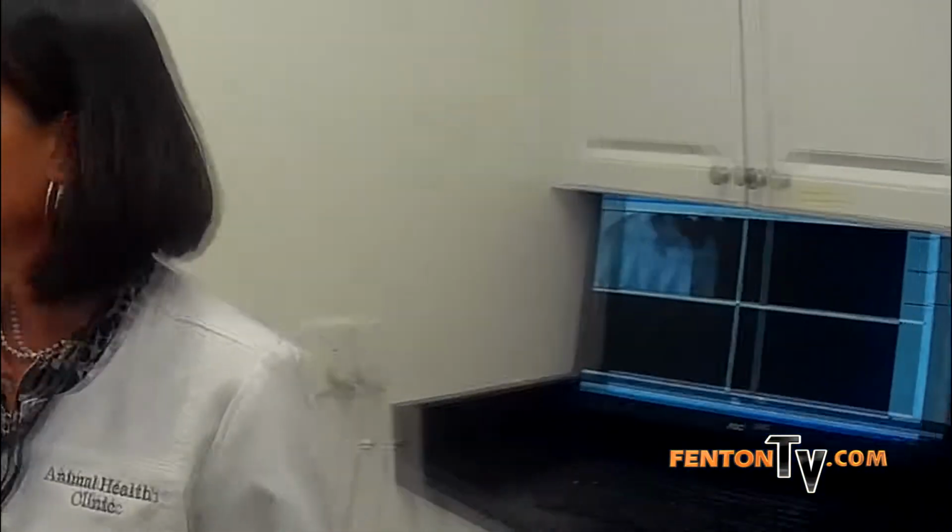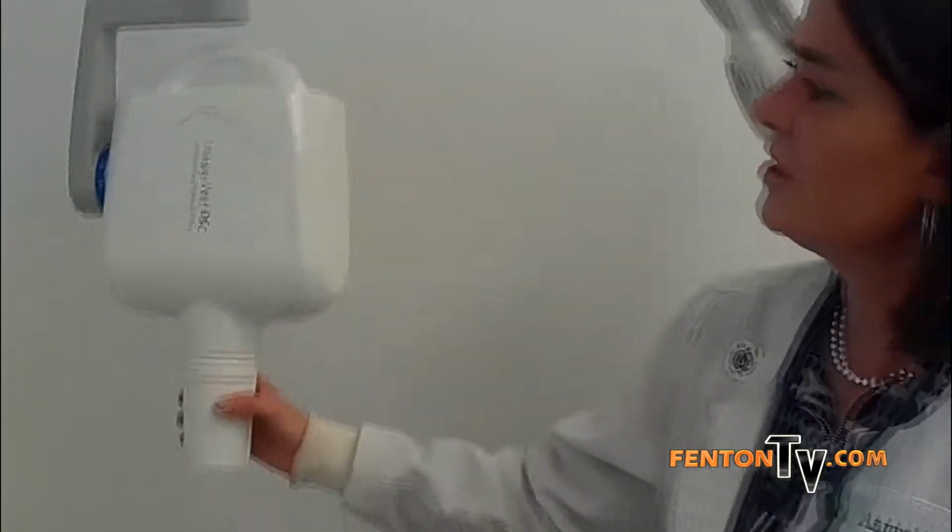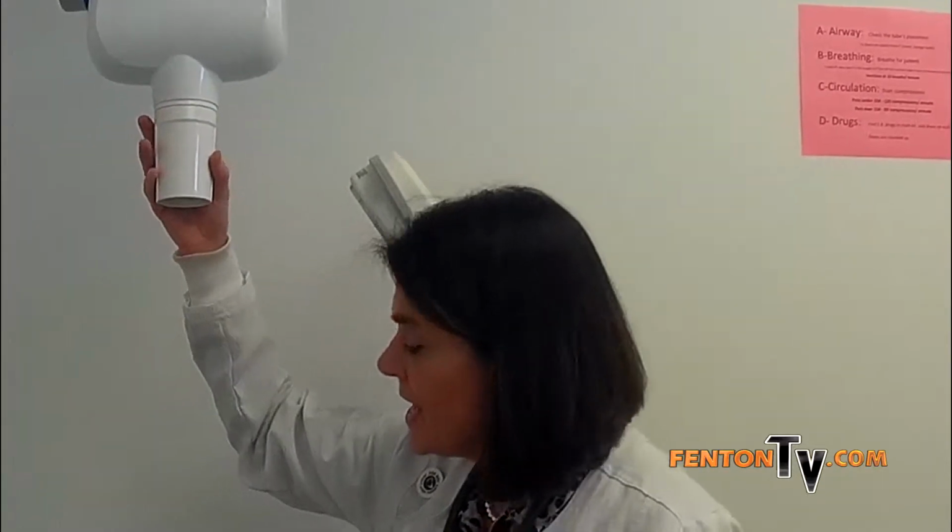If we have any teeth that are questionable, we will then move on to this piece of equipment right here, which is our digital dental x-ray. This allows us to look not only at the external surface of the tooth, but the internal surface of the tooth and all the structures that lie below the gum line, such as periodontal ligaments and teeth root. I'm assuming most of you have had dental x-rays yourself, so you probably know how these work.